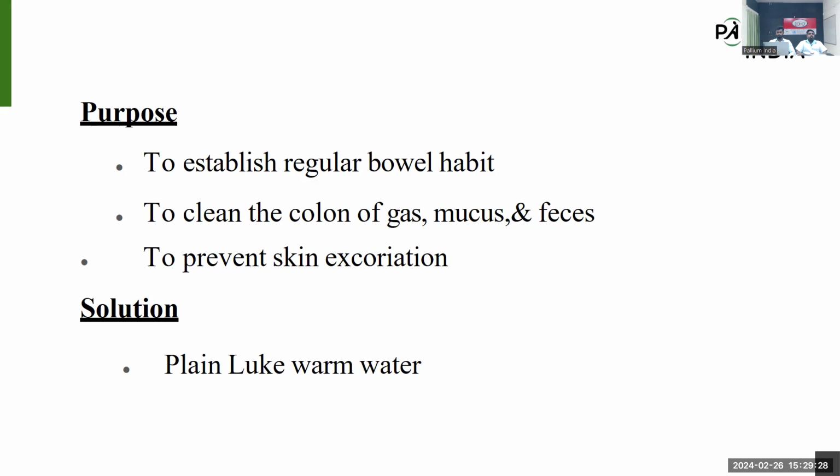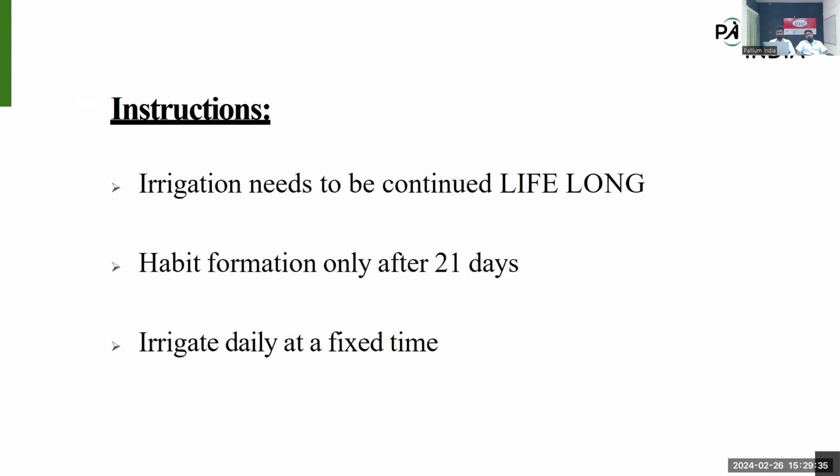The solution we mainly use for irrigation is plain lukewarm water only. Next. Here we need to give instructions to the patient and family.